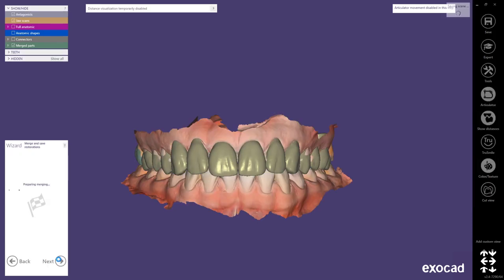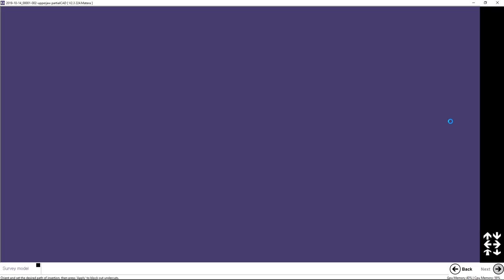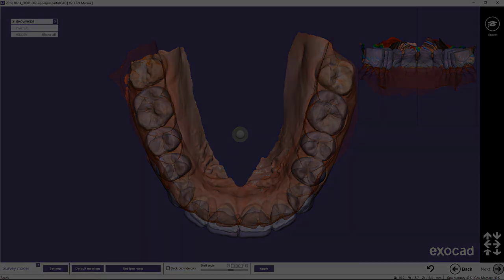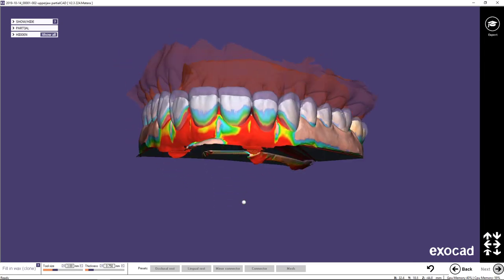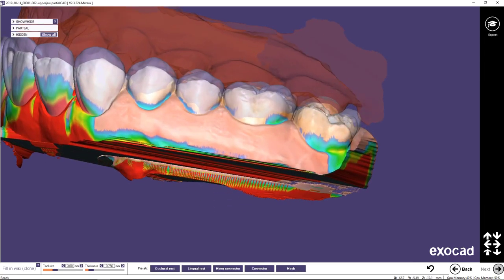We are done with our design and the whole object gets merged. The software will close down and we get back to the dental DB. Once back in the dental DB I'm clicking on design partial to start the partial framework software. For the survey model I'm deactivating the block out undercuts — you can alternatively select a negative draft angle as well. Now I'm clicking next until I reach the step fill in wax clone tool.